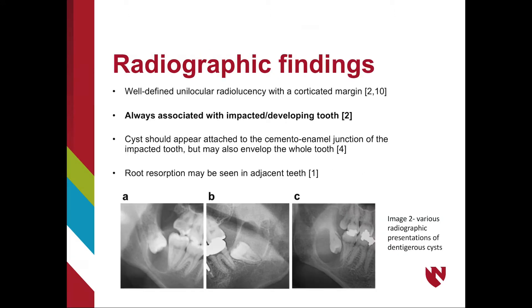Radiographically, a dentigerous cyst appears as a well-defined unilocular radiolucency with a corticated margin. There will always be an impacted or developing tooth associated with the radiolucency. The cyst will appear to be attached to the CEJ of the impacted tooth but may envelop the whole tooth. Dentigerous cysts may have an effect on surrounding structures, including root resorption in adjacent teeth. In image A, the cyst is attaching to the CEJ of tooth number 32, and there is resorption of the adjacent tooth visible in image C.